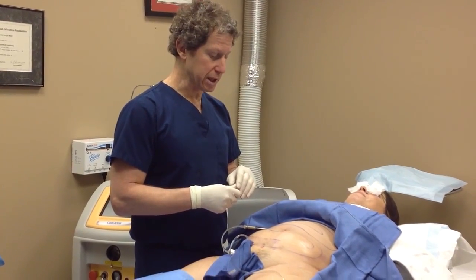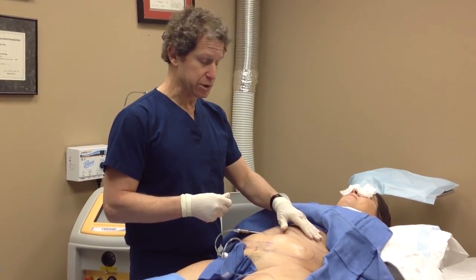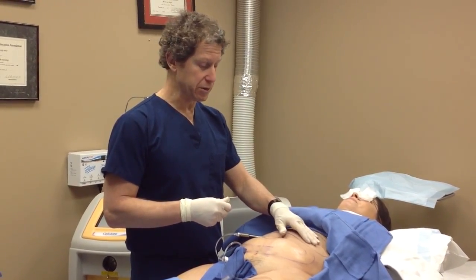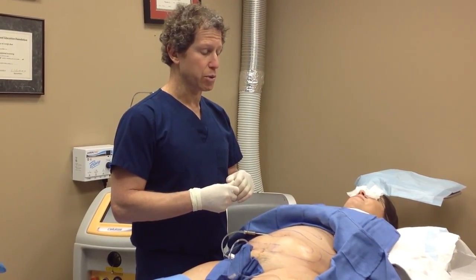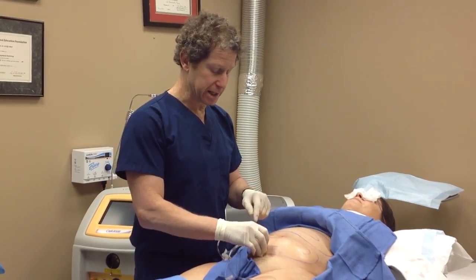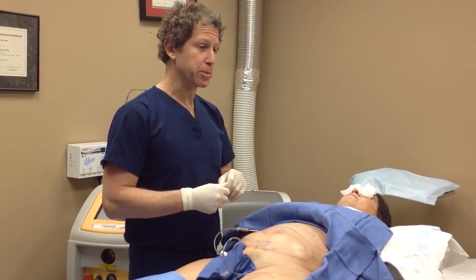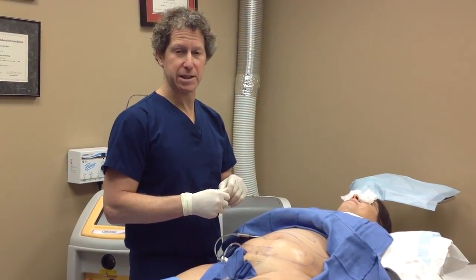The next step, which we'll show you shortly, is passing the laser fiber underneath the skin — which is already numbed up — melting the fat. The last step will be liposuctioning the fat. I'll then close these tiny incisions with one little suture, apply a Steri-Strip, and then she puts on a pair of Spanx or Spandex.